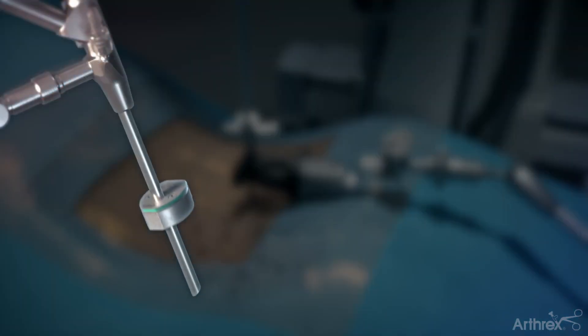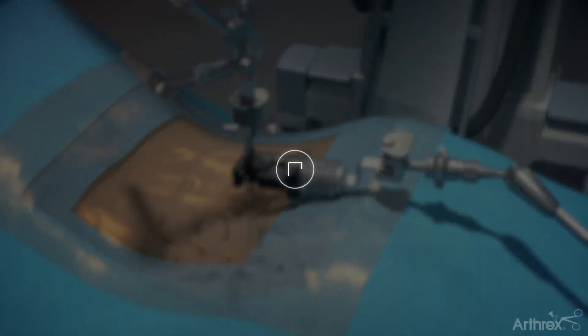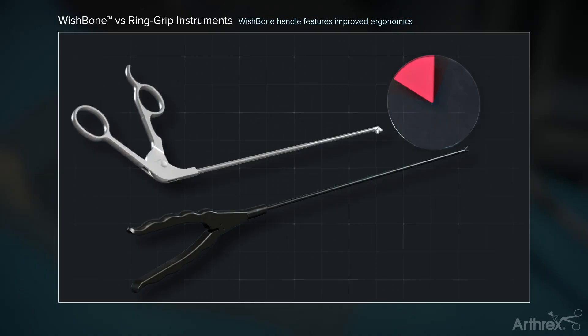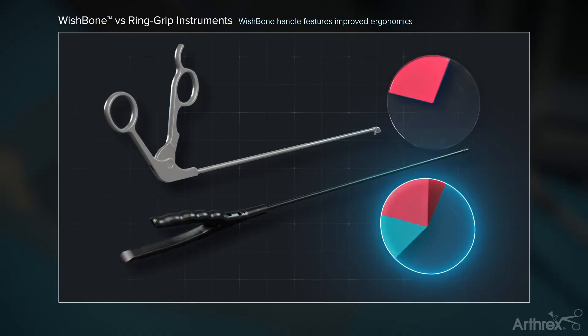A depth stop may be attached to the endoscope to maintain the depth within the cannula. Arthrix offers a unique wishbone handle design that allows for improved ergonomics and mobility of the instrument by the surgeon.